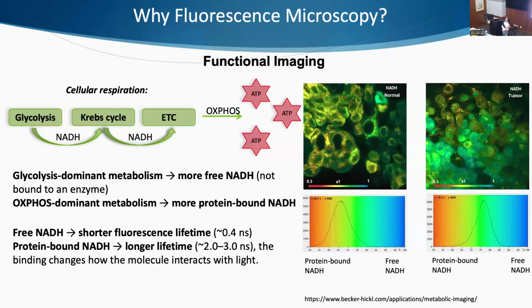Yes. And Mihaela, let me interrupt before going into the biological significance. I wanted to perhaps try to connect with a concept that Professor Padma mentioned in his lecture. He mentioned that the fluorophores that have quicker lifetime is most likely because there's higher relaxation due to non-radiative transitions. And that often occurs because the fluorophore bumps into other molecules and transfers energy to the other molecules, which allows for a non-radiative relaxation mechanism.